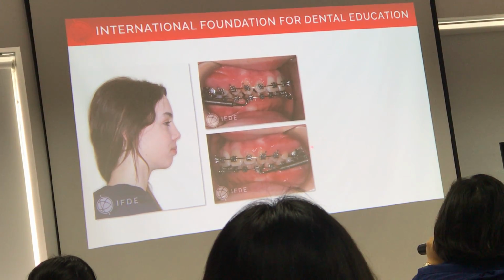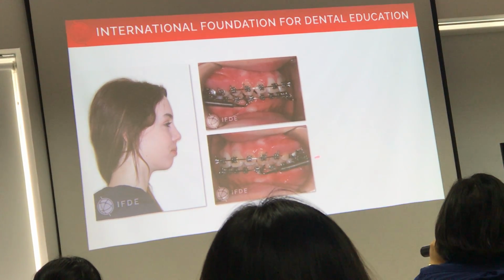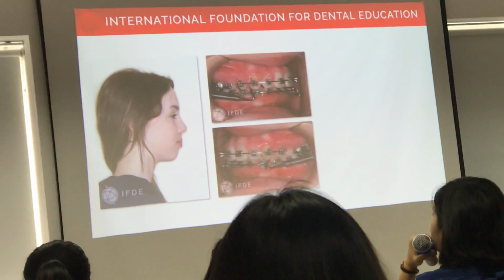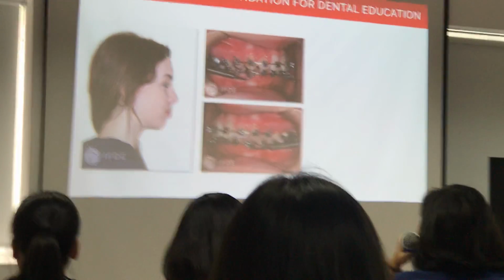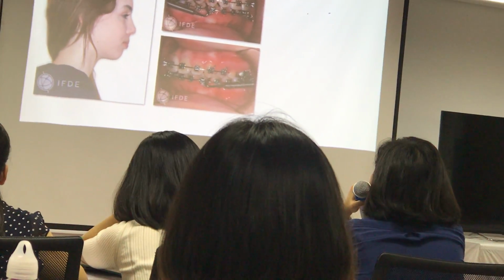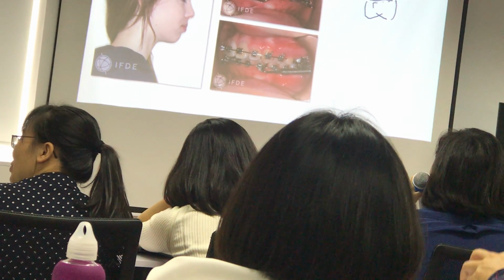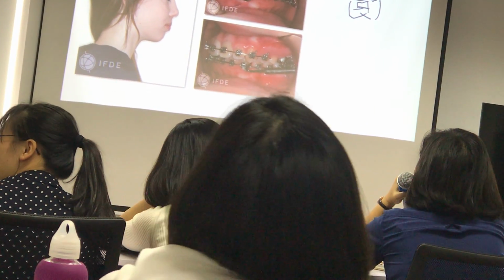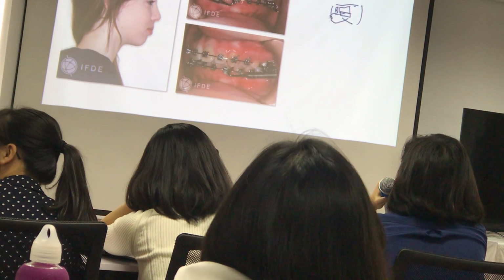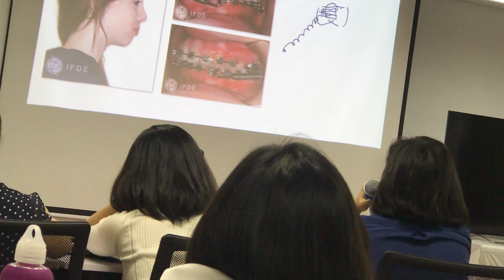Someone wants to know which poses. Can you draw the way that you put the forces? Because you said that you put it physically. I'm not that good at it, as you know, but I'll try. If you put a molar here, I'm just going to draw the molar because the incisor is the same. The molar is here, and you have the heavier tube and the regular tube. Normally you put the force here, and it goes this way. And you have this little gizmo that comes back like this.